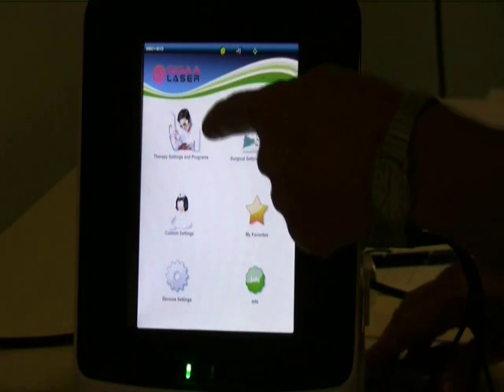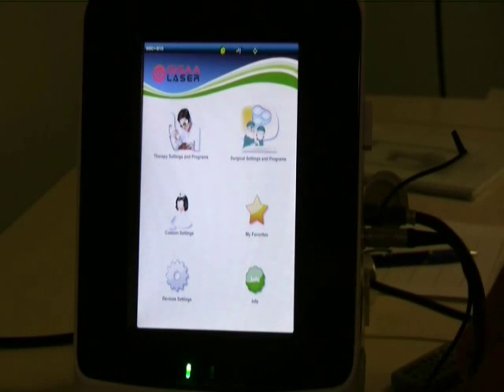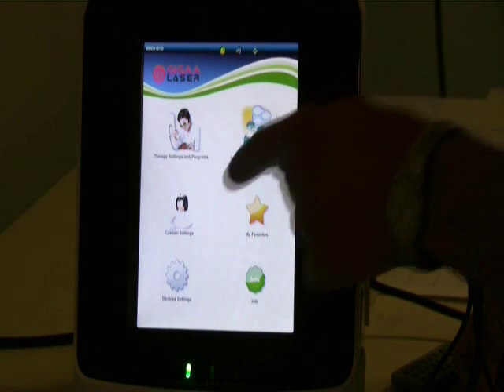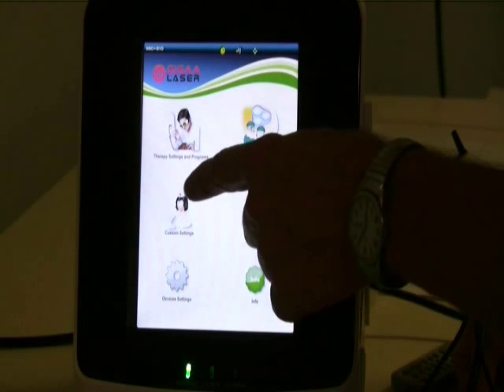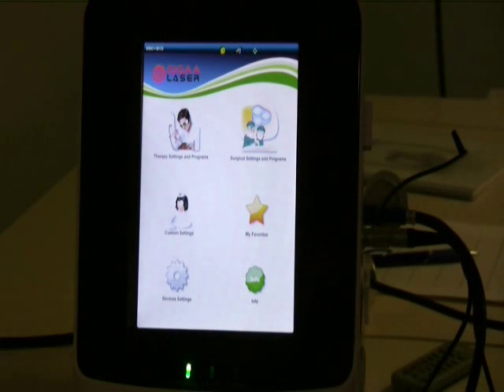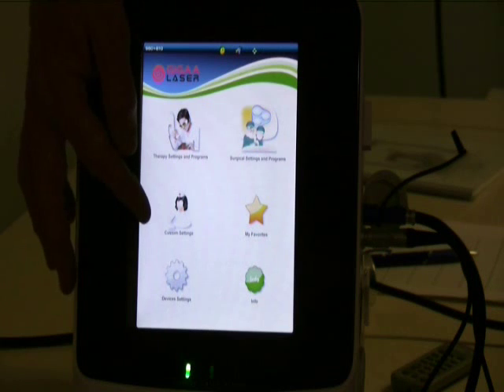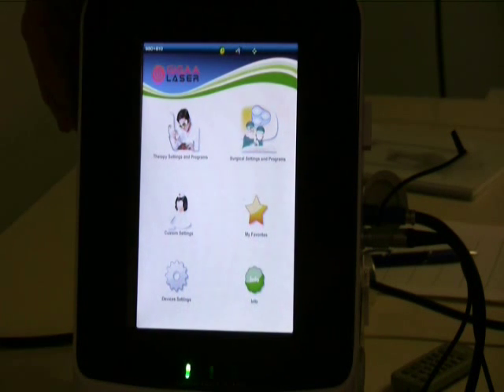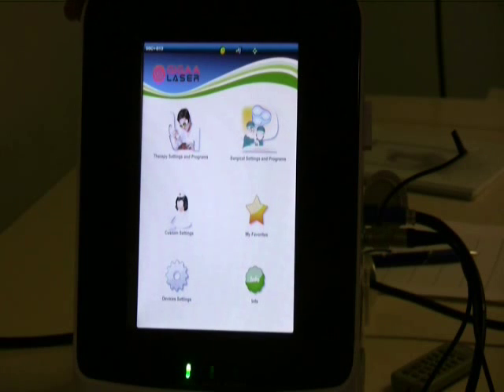Apart from the preset settings, the Gbox15AB also comes with customisable surgical settings and custom settings, which I use a lot for therapy. These custom settings are when you start to understand dosage principles, and you want to calculate a specific dose and a specific way of delivering it for each patient you come across. The example I'm going to use today is a cat we've been treating for quite a while now, Tabitha Boyle, who has osteoarthritis virtually all the way along her spine and both of her hips.